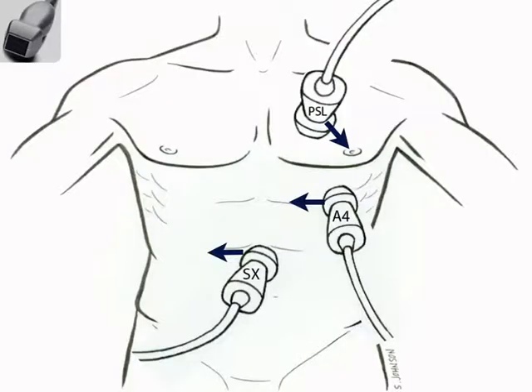So recall that last year when I came to you, we talked about the different locations to point the probe, and the one way is here against the parasternal long axis. This is where, as its name suggests, parasternal, para means next to, sternum. You place it right along the edge of the sternum and you aim the indicator down towards the patient's left, somewhere between, if their arm was at their side, their left elbow or their left hip, in this kind of direction this way.